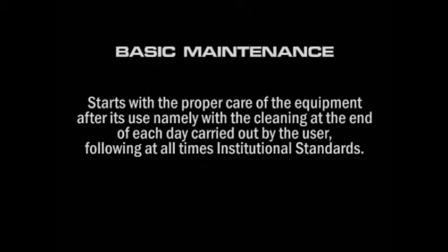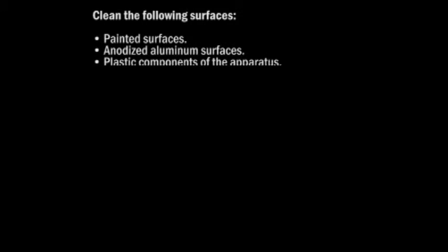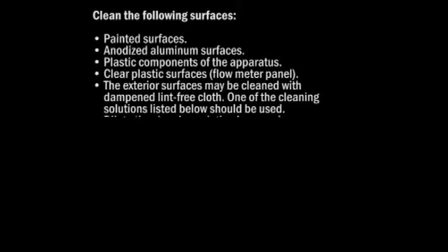When cleaning the apparatus, great care must be taken to prevent liquid entering components. Clean the following surfaces: painted surfaces, anodized aluminum surfaces, plastic components of the apparatus, clear plastic surfaces, flow meter panel. The exterior surfaces may be cleaned with a dampened, lint-free cloth.